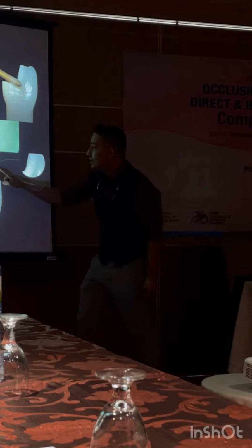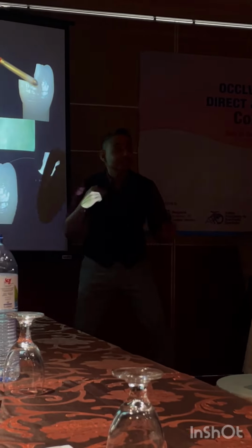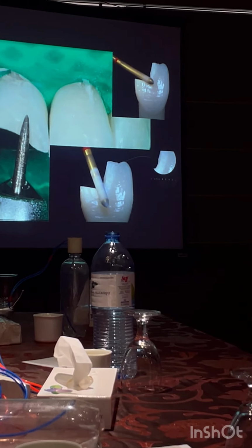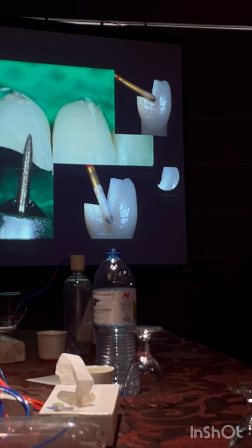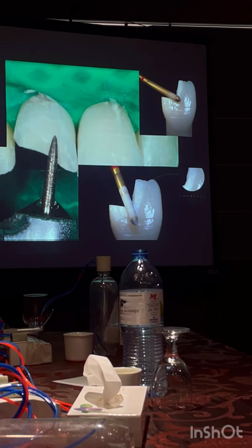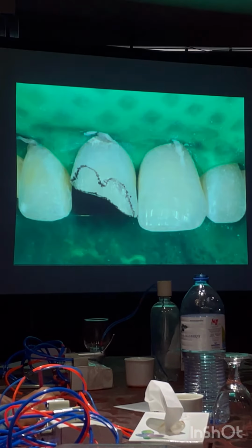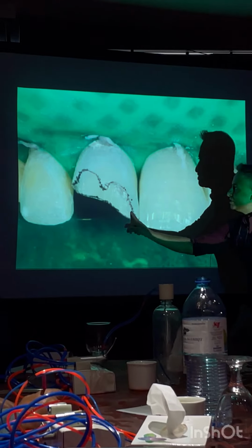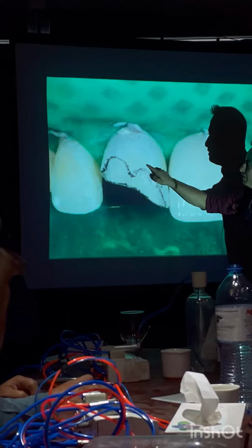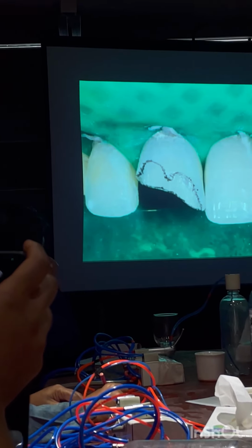Now when everybody gives this bevel, you get a straight line. Can you see this line? This is the line you need to break with the second bevel. Because eyes can see whatever is straight. Eye cannot see whatever is curved or scalloped. Is it very clear? So now after this, I mark my second bevel. So long bevel is already there. I take a pencil and mark a curved bevel over the long bevel. Did you understand? Are you with me?